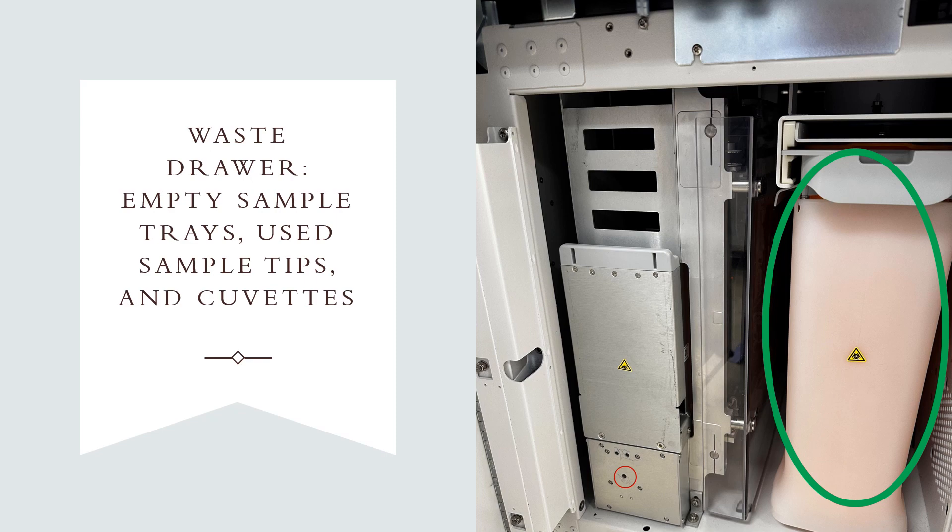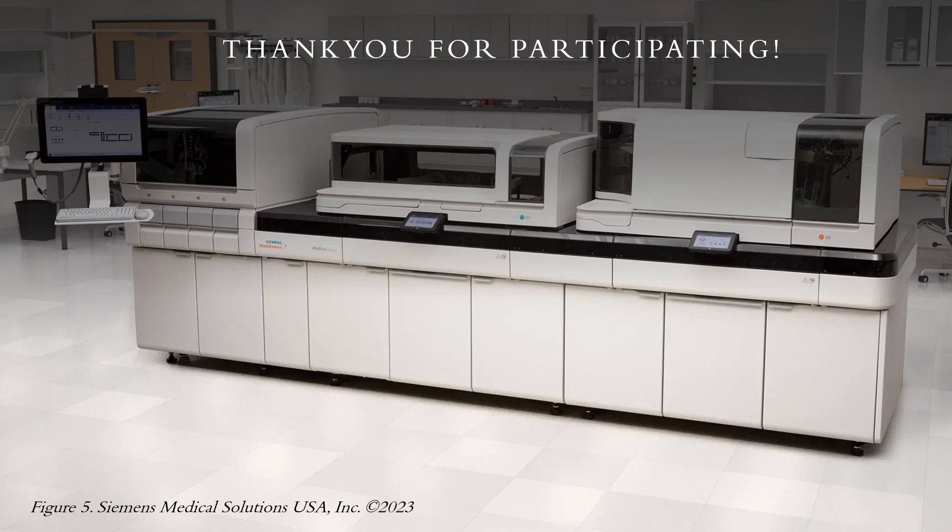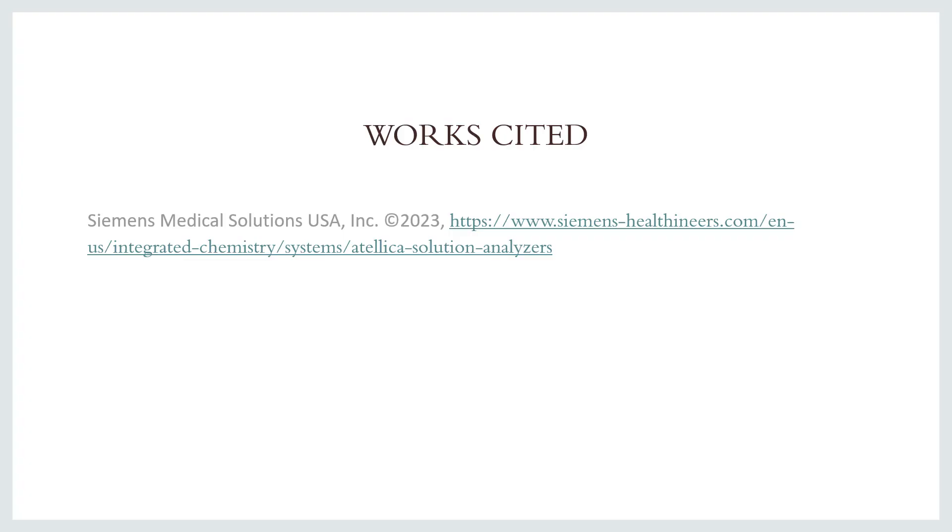After emptying and checking for additional obstructions, you are now able to resume the analyzer and continue processing patient samples. That's the conclusion of this presentation. I hope that you're able to resume processing patient samples quicker and more efficiently. If you're not able to locate the jam by these methods, definitely contact Siemens Support and they will be able to assist you with further troubleshooting. Thank you.